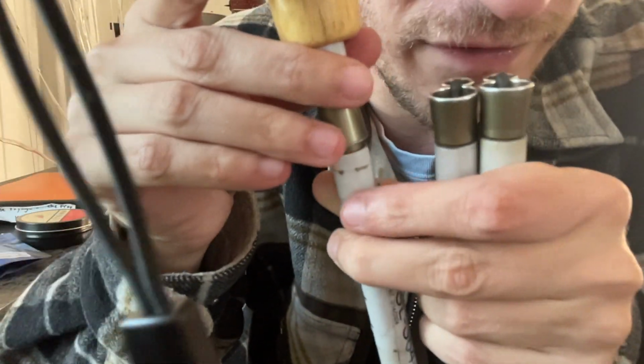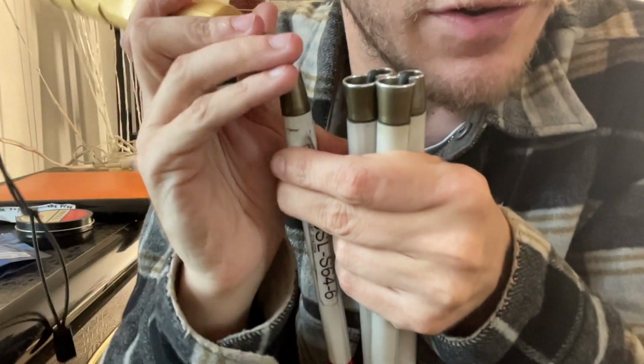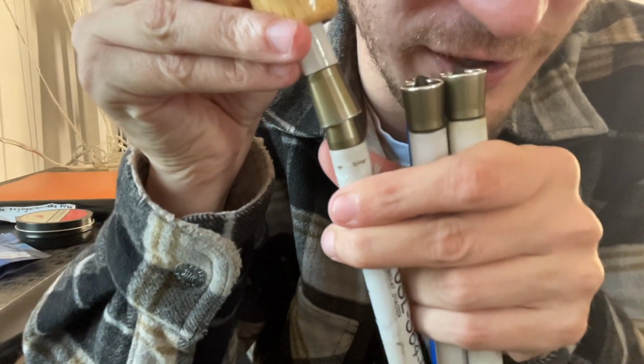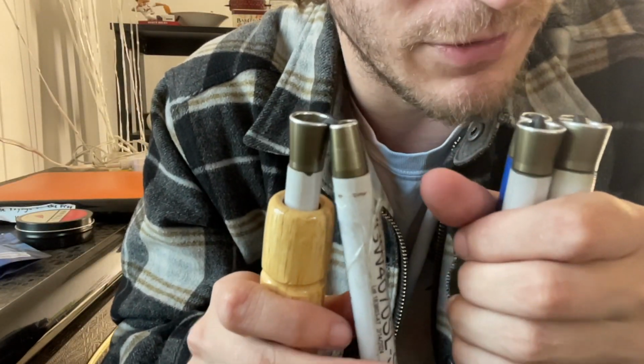And as I pull up to fold it, when I was little, you'd have to pull way up like this and then kind of drop it down, because they were very long pieces of mostly straight aluminum. And so now, as soon as I lift it, it starts to bend, and it can drop right over. So it's a lot faster and more efficient to fold, which I appreciate.